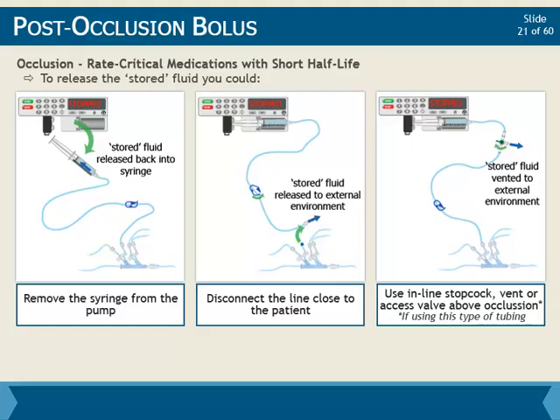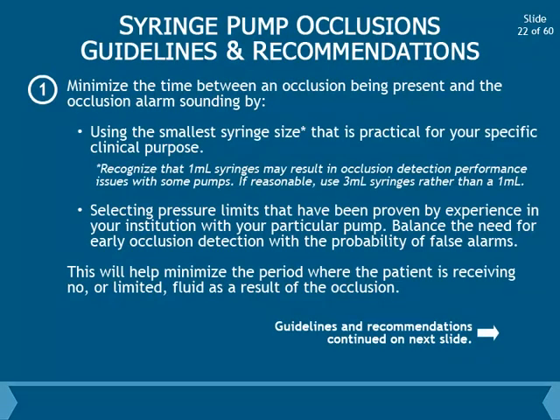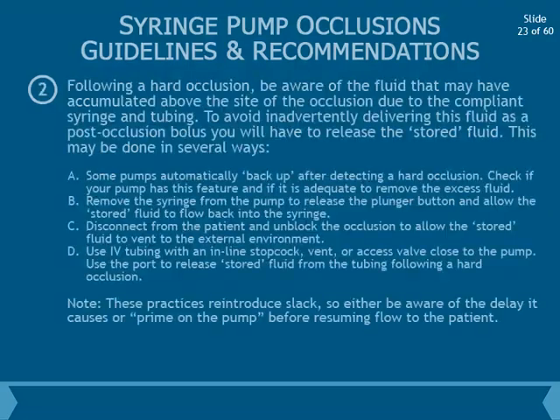However, please be aware that all these practices will reintroduce slack, so recognize that you will have to either remove slack again before restarting, or be aware that there may be a further delay before your patient will again start receiving the fluid. With regards to occlusions, here are some guidelines and recommendations for consideration in helping to mitigate some of the topics we just discussed.